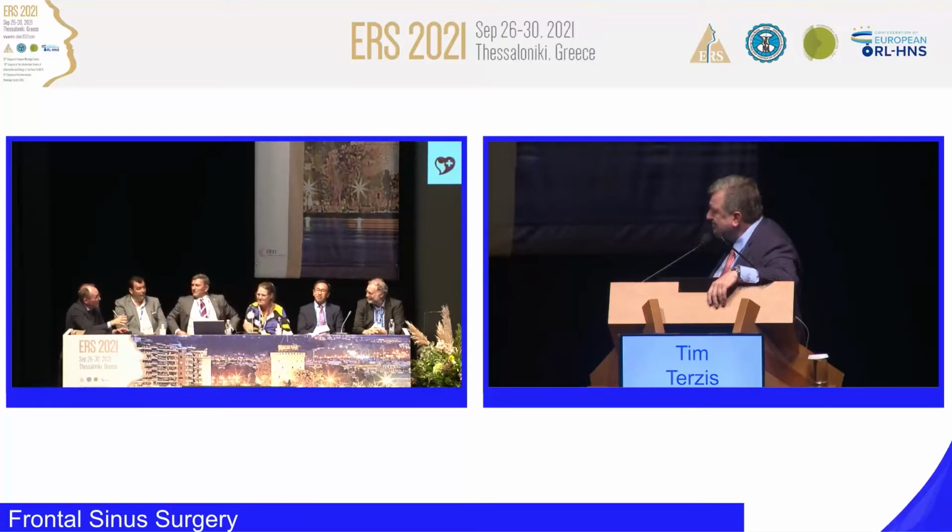Because we should start first thinking and then operating, or maybe not. I mean, do you have more scans? I would look at the anterior ethmoid cavity a bit more, because I have cases with an osteoma like this, and the problem was not the osteoma itself, it was more in the anterior ethmoid cavity, maybe.